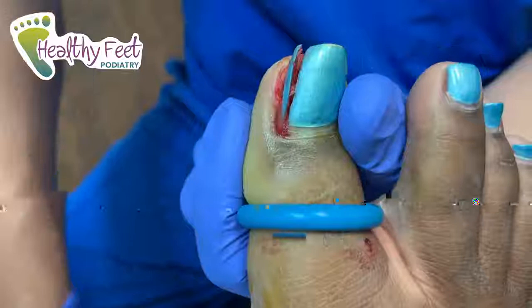Okay, so let's clean all the rest of this nail out. We'll make sure we didn't leave any nail matrix in there. We don't want regrowth, right? One and done, baby. I think there's a small piece in there left. I see something, so we're gonna try to fish it out here. There it is. There you go. Okay, you see that? That was all toenail. So I'm gonna cut that out. So infections happen because sometimes doctors leave this in there. And my doctor's me. So I gotta be extra careful taking them out.